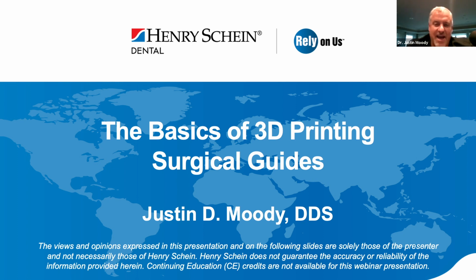So today I've been asked to talk a little bit about the basics of 3D printing and surgical guides, and what goes along with it. And I think we'll have a good time, and I'll share with you the workflow that we use in our teaching institute, as well as in our private practice and at the nonprofit center.